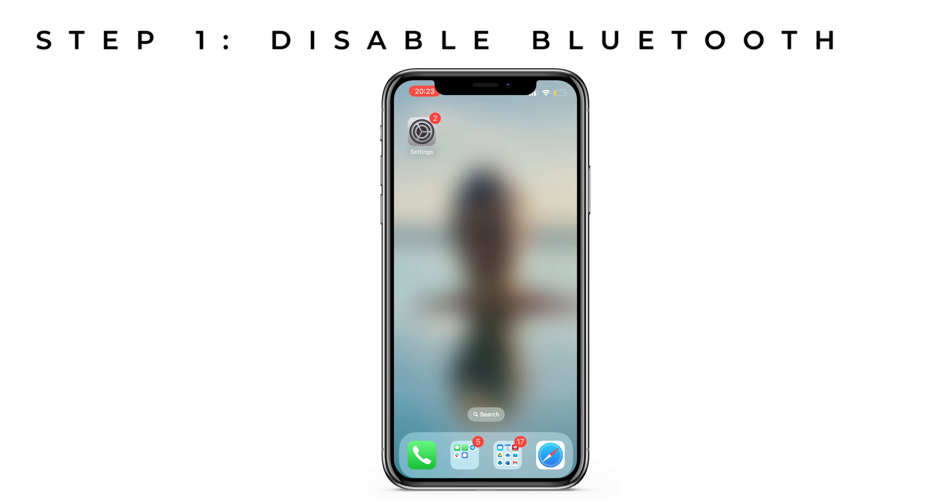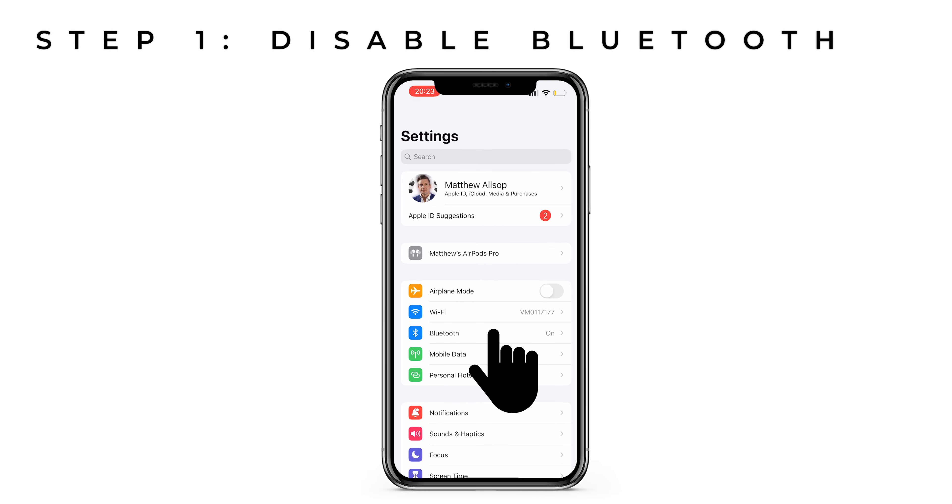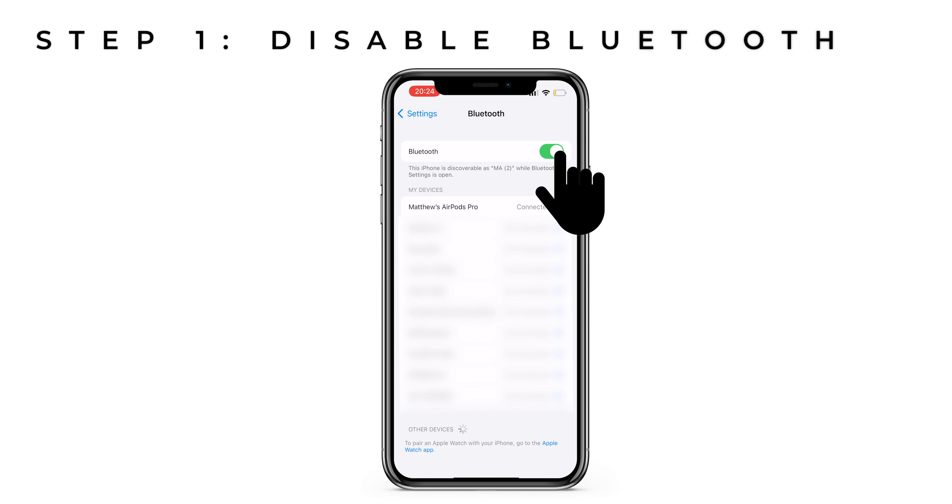To enable voice isolation, you actually need to be on a phone call, but not when the hearing aids are connected to your phone. So firstly, we need to disable your Bluetooth. To do this, head over to your iPhone settings, press Bluetooth and then press the green button so it's grey.